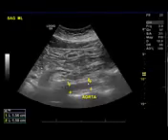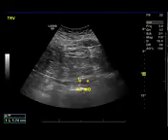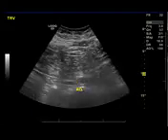Here we see the abdominal aorta. And unfortunately, bowel gas and depth of the aorta sometimes precludes its display. But here we see the mid-aorta, and the walls of the aorta having muscular layers and sometimes atheromatous disease. You're going to see them very well compared to the cava, that the walls are more delicate. So here they've put the color on, and you can see the aorta is deep. It's about 12 centimeters from the anterior abdominal wall. And here they're measuring the aorta on the transverse plane.